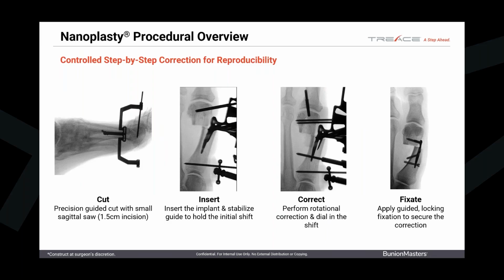proximal bicortical screw, and then you will go ahead and do a rotation correction. Once you do a rotation correction, you will then correct DMA and then pin your head to the jig. At that point, it is drill and fill. Your hands are free. You can let go of everything. You will not lose your correction. It will not change. You feel comfortable that what you have on the table is what you're going to get.